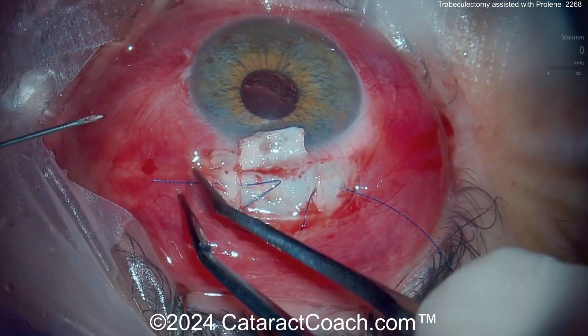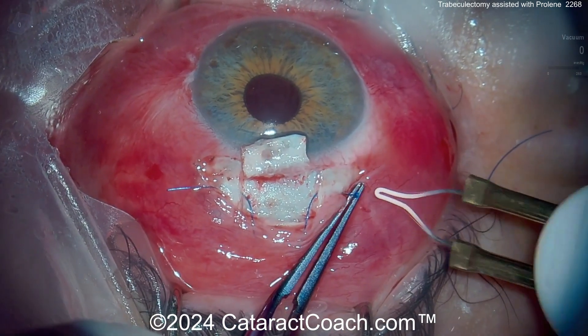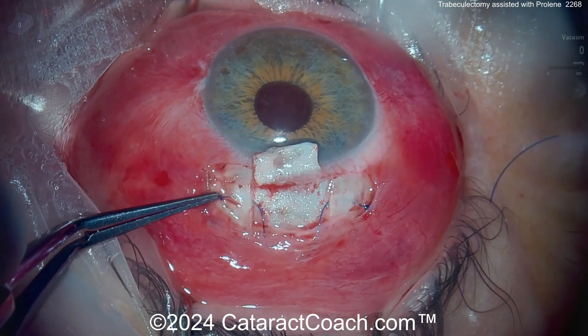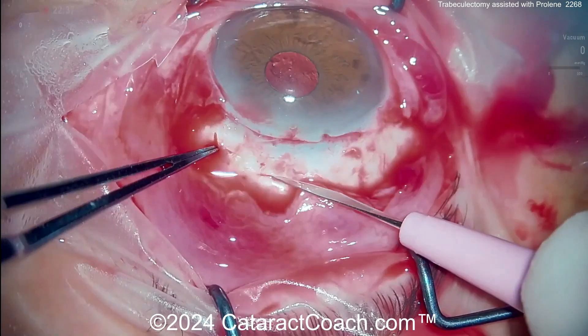A Greek letter omega. So pulling this through — there you go, there's the flap. Using a little cautery here to create some flanges, getting those flanges pushed into those pockets so they're not exposed. There you go.